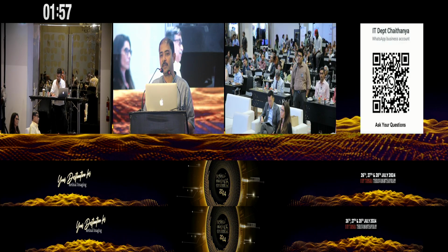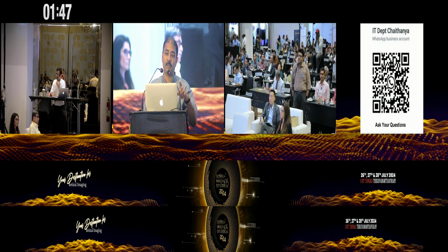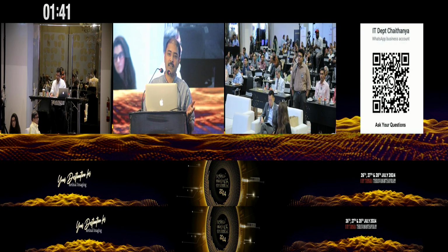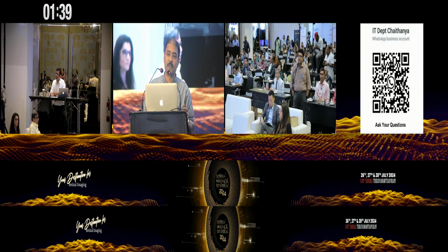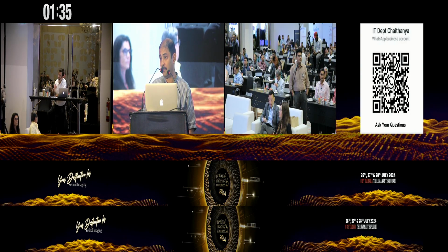No, it depends upon the location also, of course. It will depend upon the location where it is. And if the case that you are alluding to is the occurrence of the GA along with the MNV, now that is a different story altogether. You have to look at other surrogate features like we discussed earlier, DLS and HRF and other things. So there are a lot of factors which will let us know whether there is an active MNV or it is not.